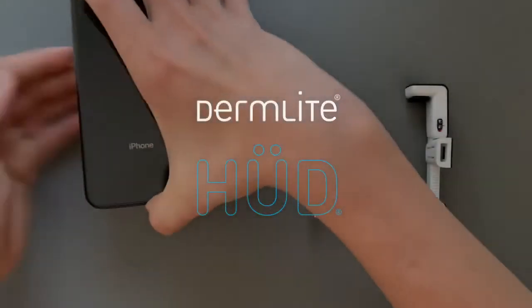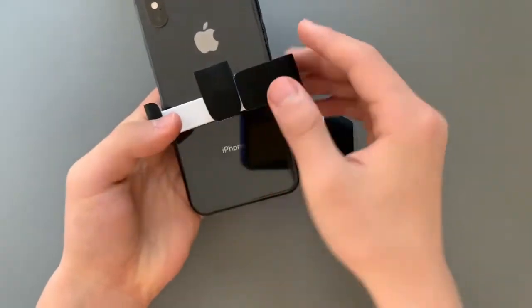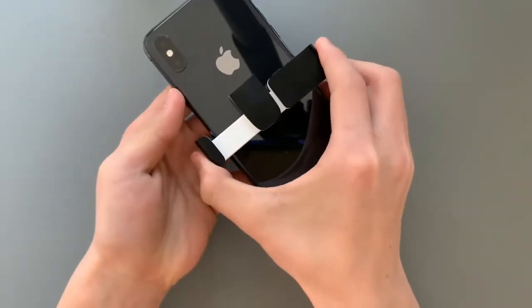This is how you use DermLite HÜD to take dermatologist quality photos of your skin lesion or scalp. HÜD fits smartphones between 58 and 78 millimeters wide.